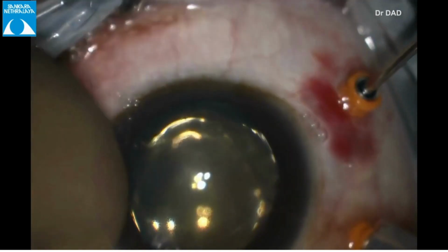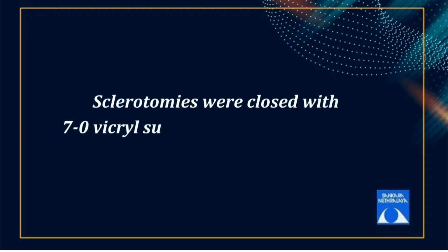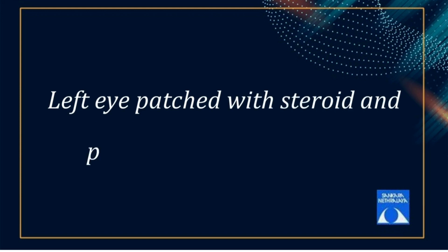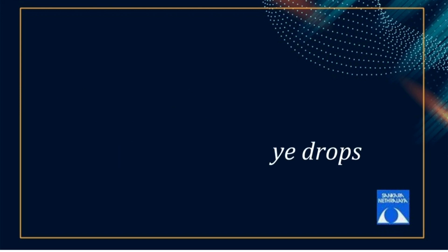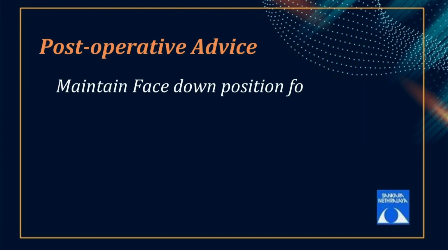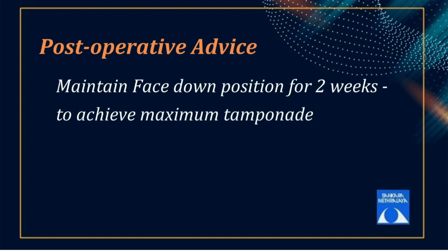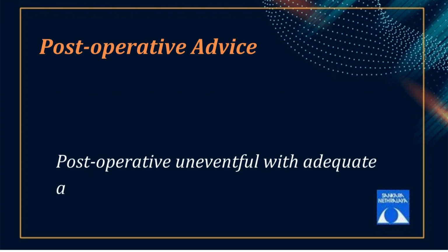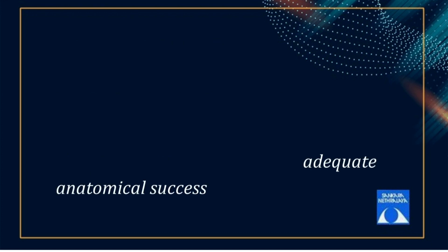20% SF6 gas was then used to exchange with air. Sclerotomies were closed with 7-0 Vicryl suture in a mattress fashion. Eye was patched with steroid and povidone iodine eye drops. Patient was advised to maintain face down position for 2 weeks to gain maximum tamponade effect. Post-operative period was uneventful with adequate anatomical success.